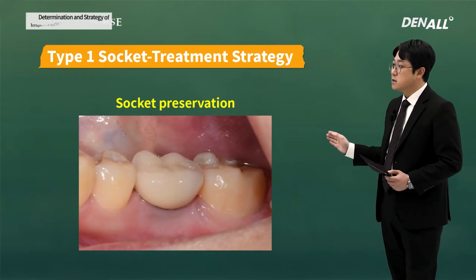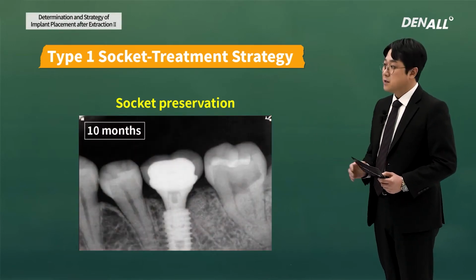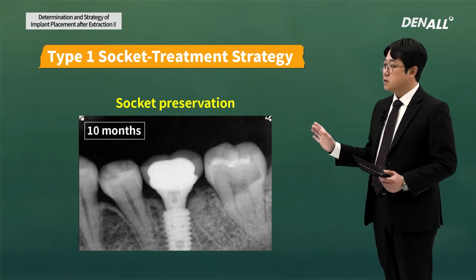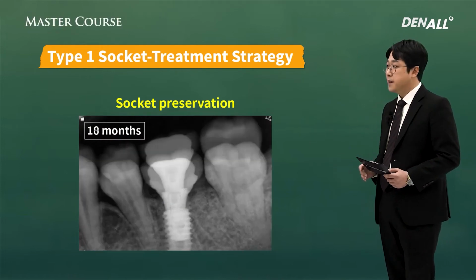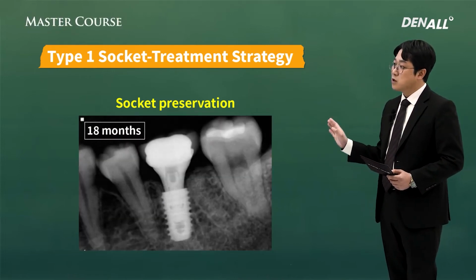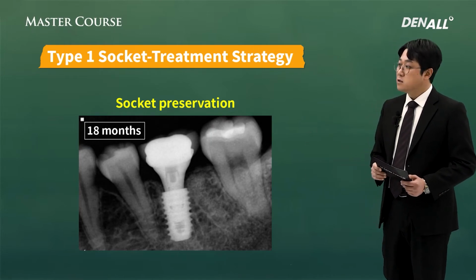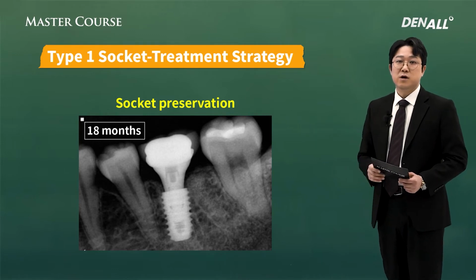This is the final prosthesis. This is approximately 10 months after extraction, and this is when the treatment was completed. Approximately 1 year, 6 months later, this is the X-ray. You can see that the bone around the implant is well maintained.